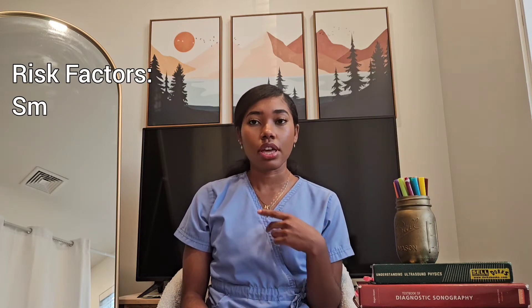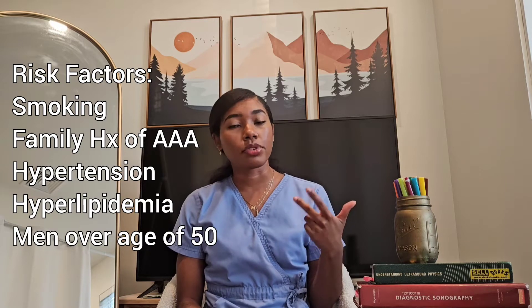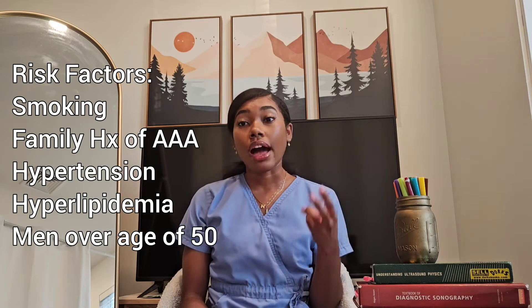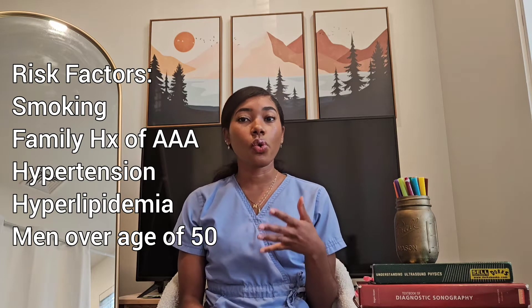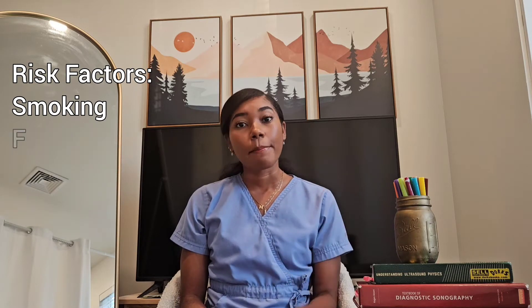The types of patients receiving this exam might have risk factors like smoking, a family history of AAA — abdominal aortic aneurysms — hypertension, or high cholesterol. Also, men over the age of 50 might be at higher risk. One of my biggest tips for learning how to perform a new type of exam is understanding why you are performing the exam.